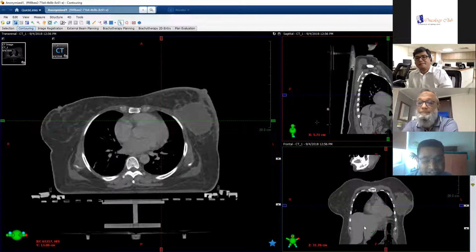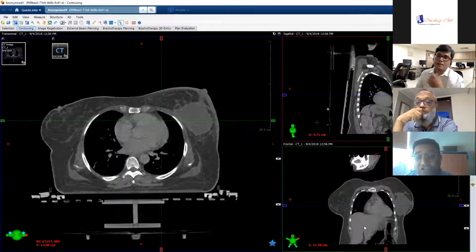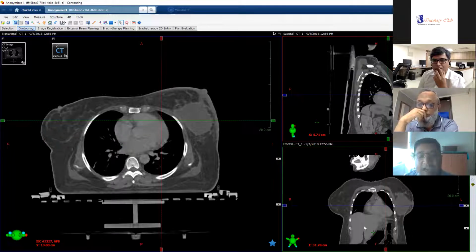Definitely, as a physicist, what you have to do, as per contouring, when you are thinking about a plan. So we have now, particularly with advanced techniques like VMAT and IMRT, we started with 3D CRT, where we have an experience of 3D CRT with half beam block, and then we extended that to IMRT with half beam block, then VMAT, then partial VMAT.